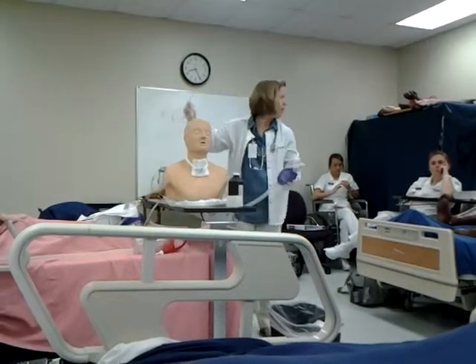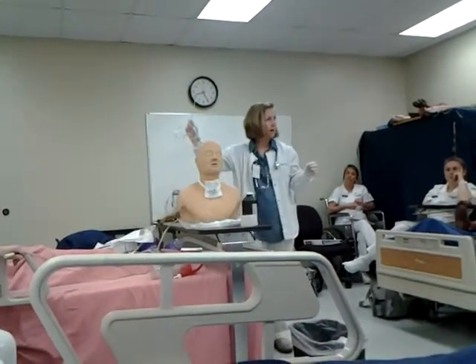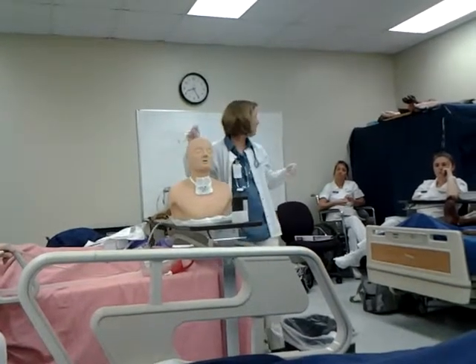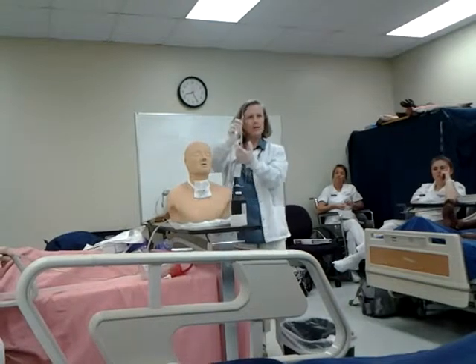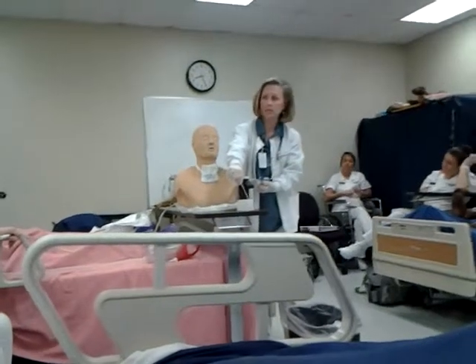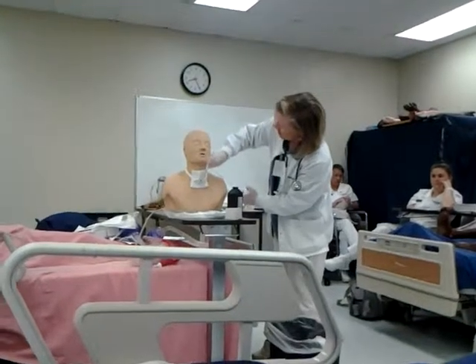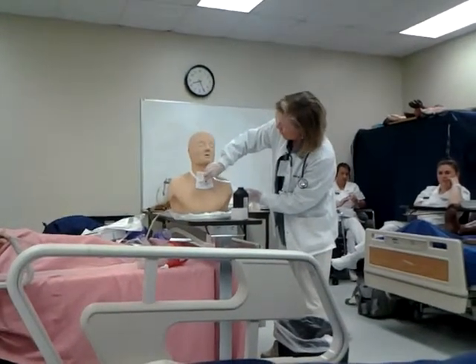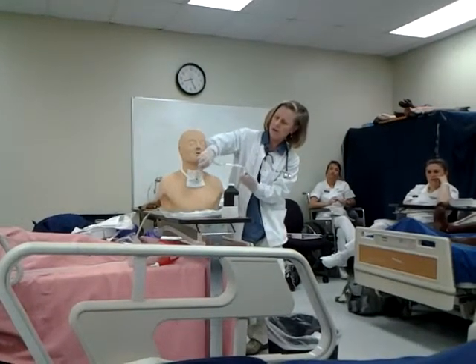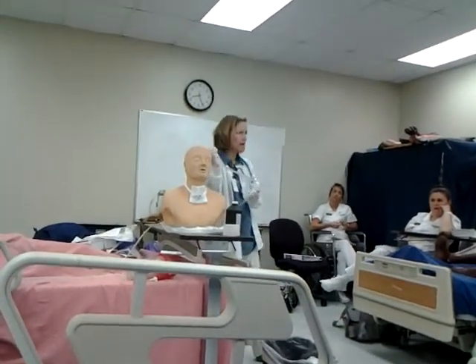Definitely need some help. Now, if they can breathe on their own, you're going to have them take some deep breaths. Okay? Or we would put their little oxygen back over here and let them breathe a few times. And then we can go down again. I may need to clean my tubing, suck up some of that saline. All right? We're going to go back down again. When you go down, I've got it down. I'm going to plug up my little port, rotating my tube, coming out. So that's pass two.